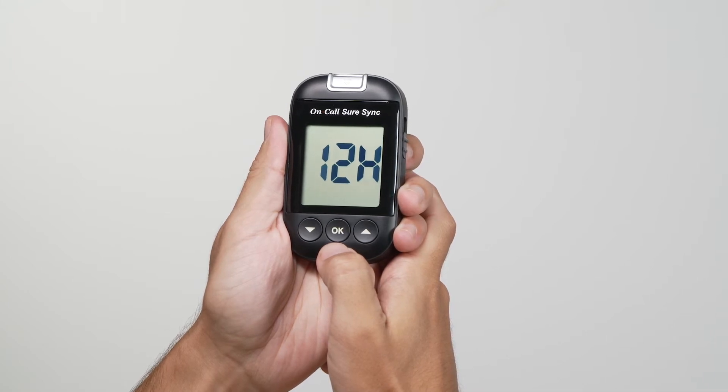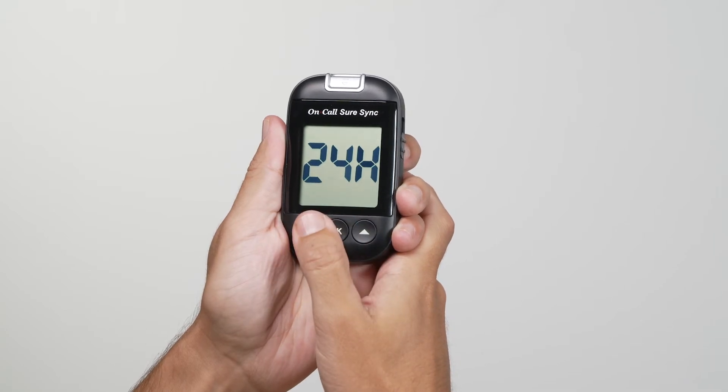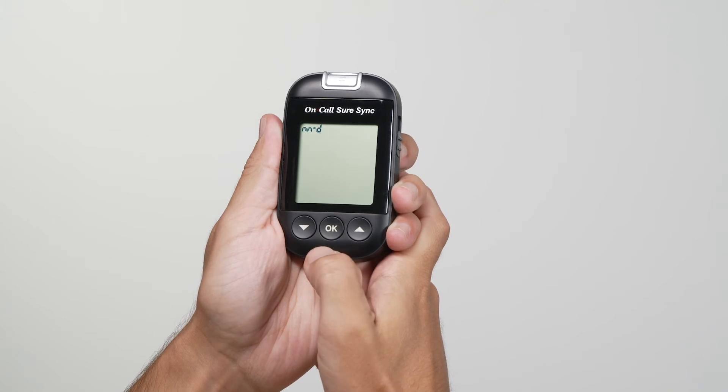Set the clock for either 12 or 24 hour mode. Press the down or up button to switch between the two settings. Then press the OK button to save your choice and then start setting the date format.